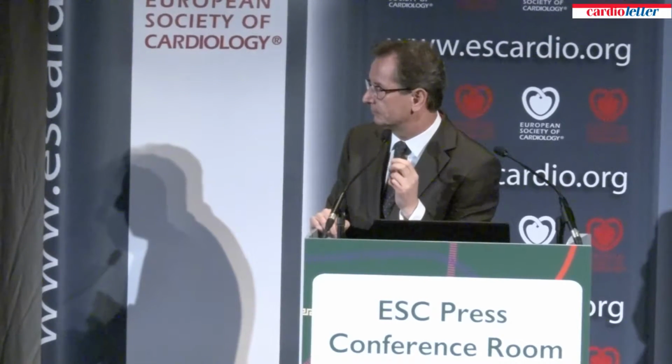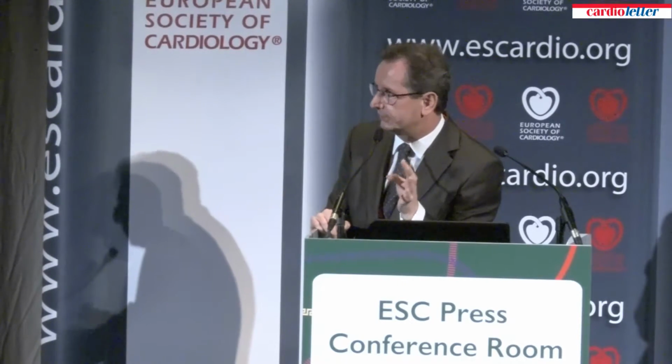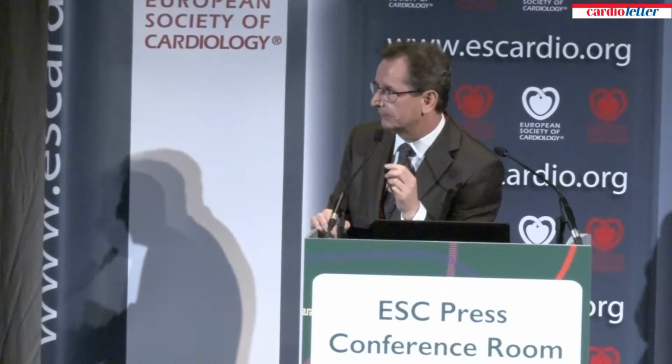So you're saying with culotte stenting, the technical benefit is you definitely get coverage of the ostium. Exactly. Whereas with TAP, even in your good hands, you might have missed it sometimes. We have 2 more questions.